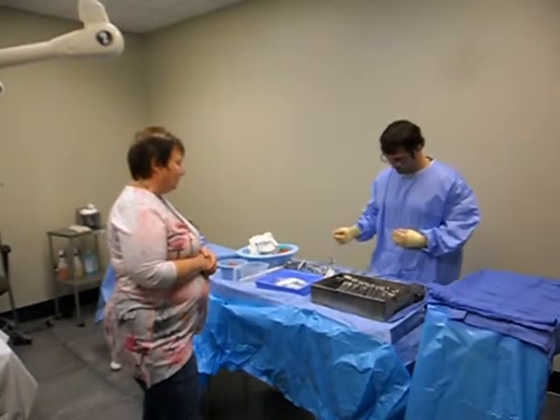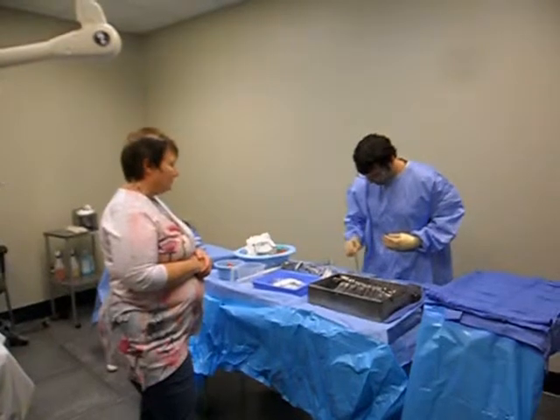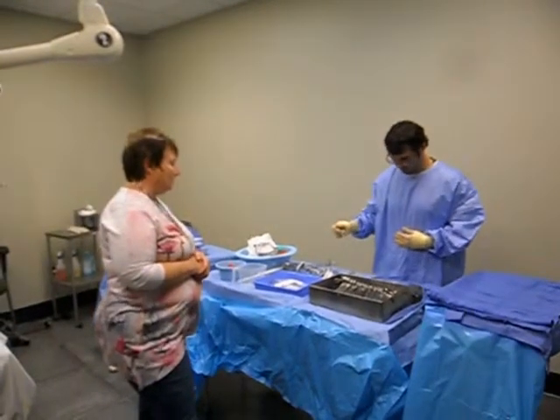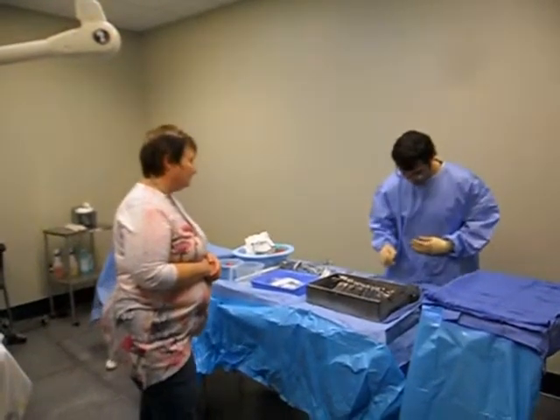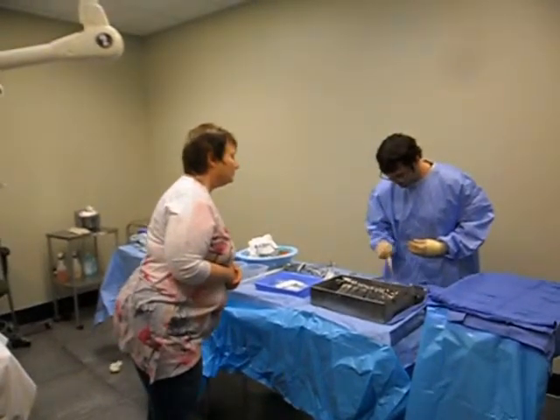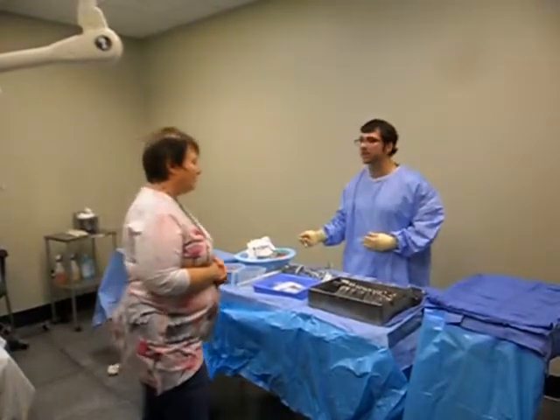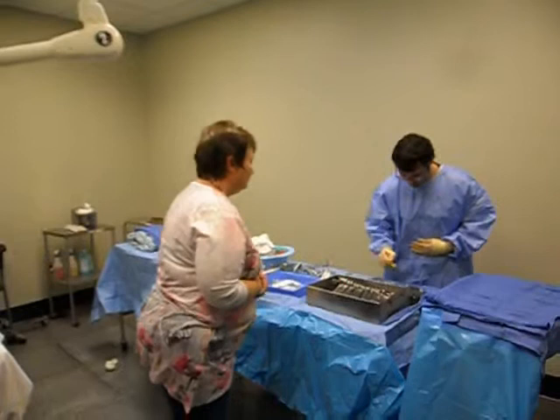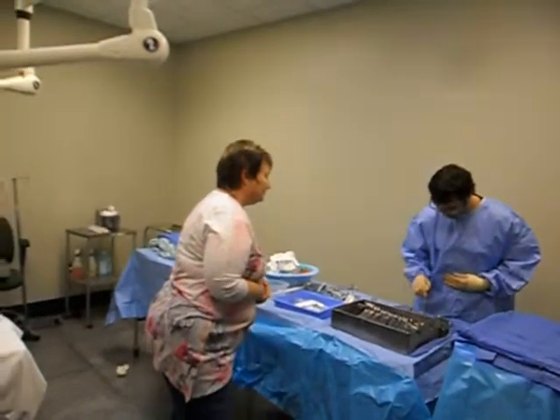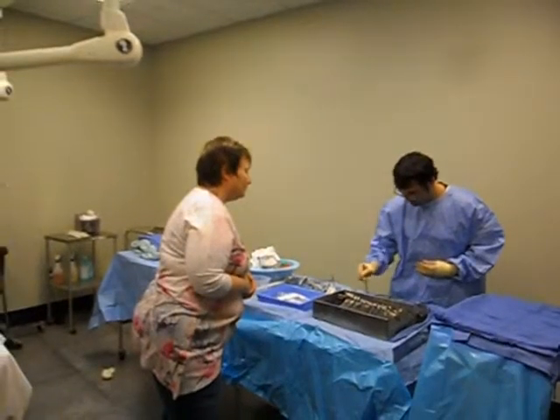Open tissue forceps, 1, 2, 3, 4, 5, 6, 7. Retractors, 1, 2, 3, 4, 5, 6, 7, 8, 9, 10, 11, 12, 13. I might have to have 14. Do you do that again? Go for it. This one? Yeah, 1, 2, 3, 4, 5, 6, 7, 8, 9, 10, 11, 12, 13.